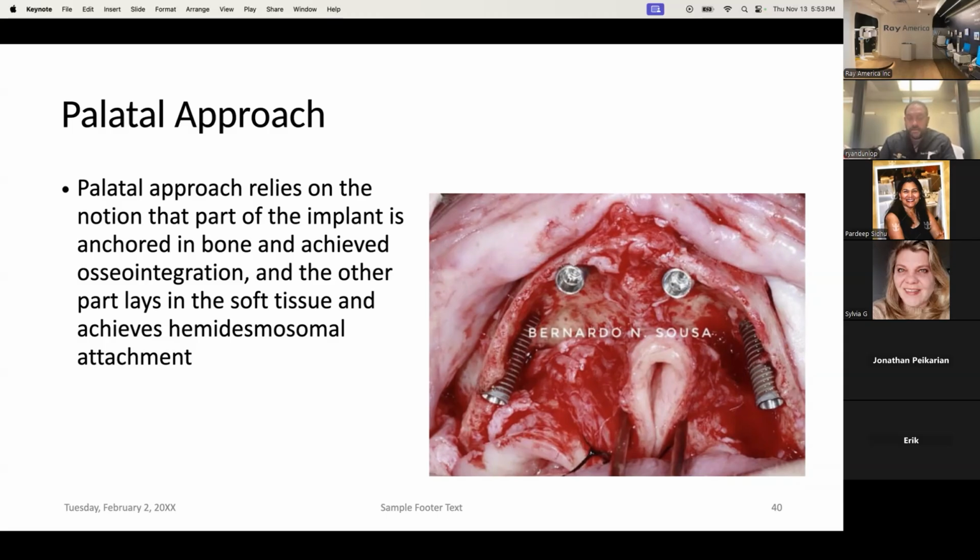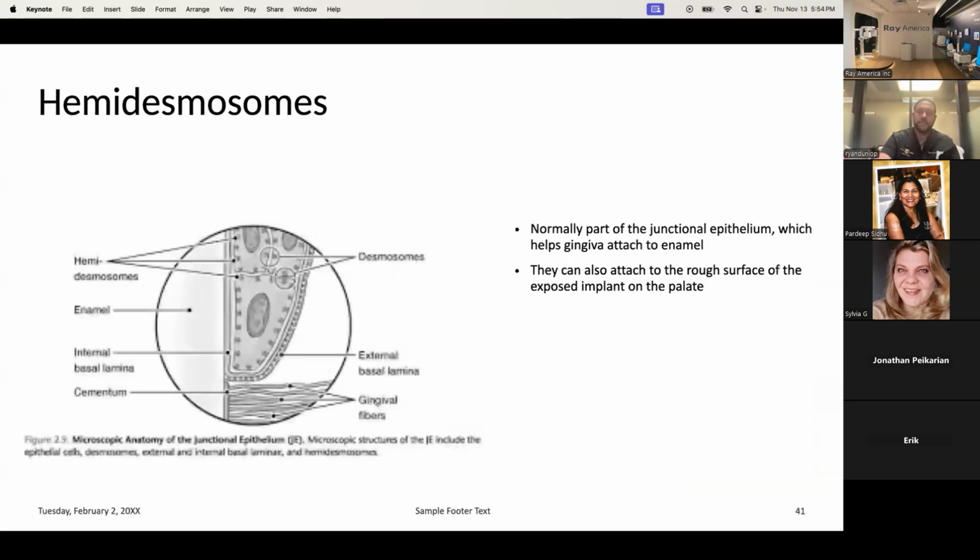Patients can get rid of their dentures and they can start living life the way that they want. And you have to understand these people are pretty resorbed, so they're not even doing well with dentures. They're not eating, they're not keeping good nutrition, their self-esteem is in the gutter. And so you can really give somebody a beautiful new lease on life by doing this.